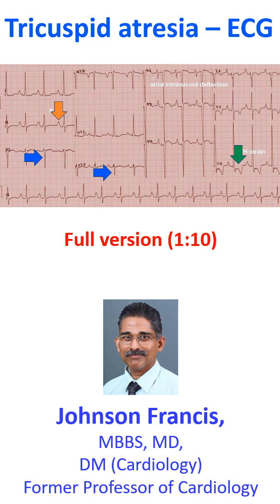The biphasic P wave in V1 with sharp atrial intrinsicoid deflection — the sharp downward deflection from the peak of the P wave to the trough of the P wave — is a pseudo left atrial overload pattern seen in right atrial overload.